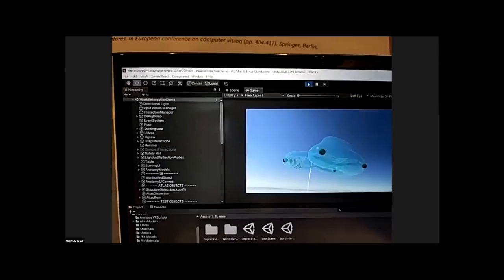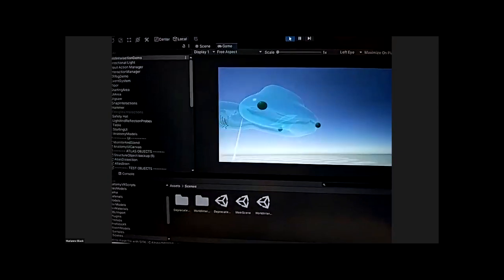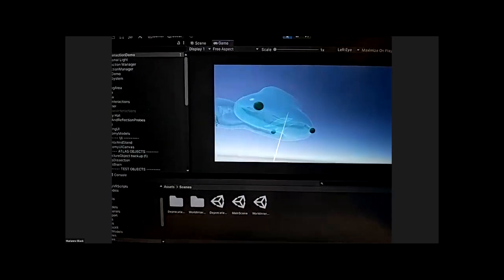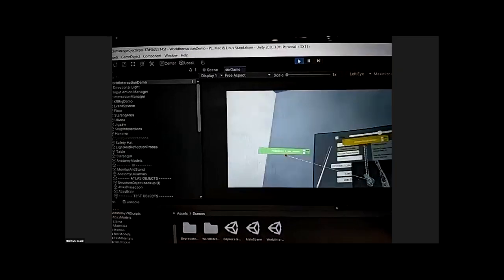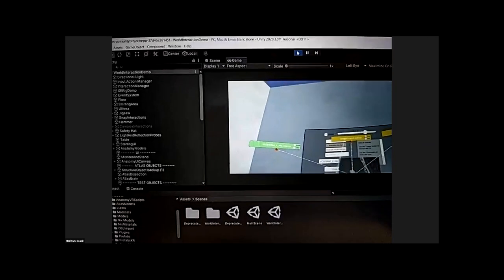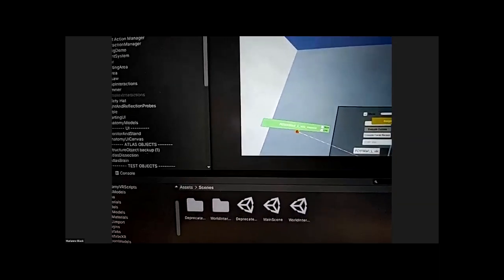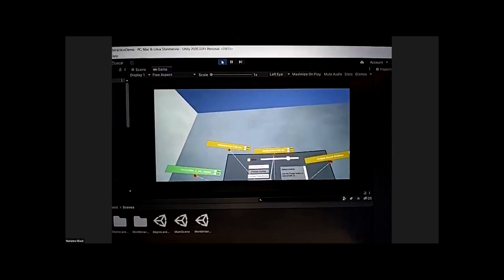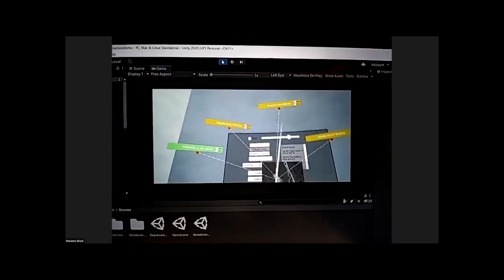And that will allow you to, for example, take certain measurements that can help the surgeon personalize the surgery before the surgery for a particular patient. And here you can see that analysis, like the different markers that you saw, you can see over here where they are located, and particular dimensions.